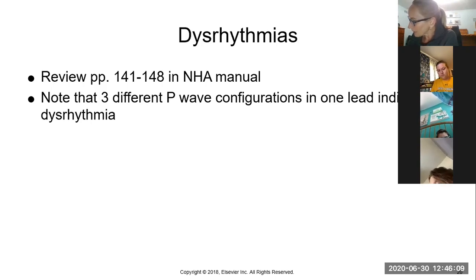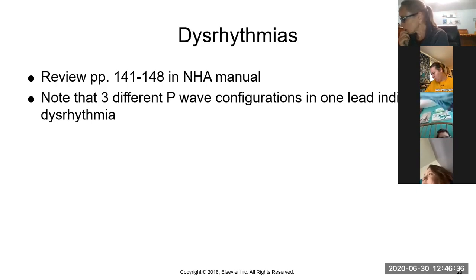So, you know, that tachycardia on page 141, you can kind of see how that looks and get used to it, maybe go over this several times. Make sure you look at AFib and A-flutter for sure. On 143, the supraventricular tachycardia, I've seen that quite a bit on things that we've gone through.